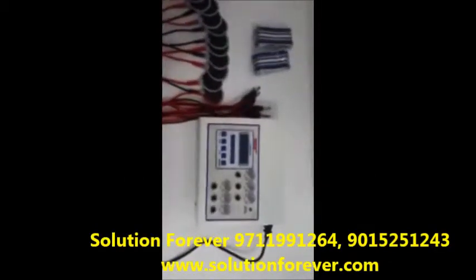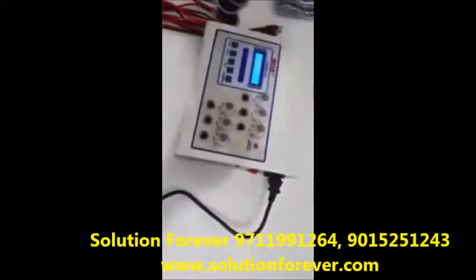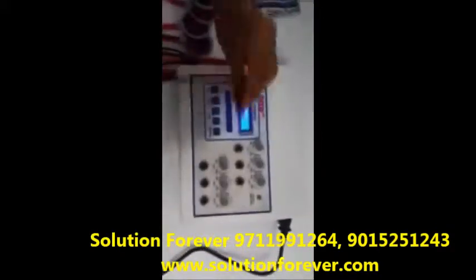Now we will show you the demo of ECHO TENS UNIT SIX TENER LCD BASE. Switch on the machine. Attach wire and pads.